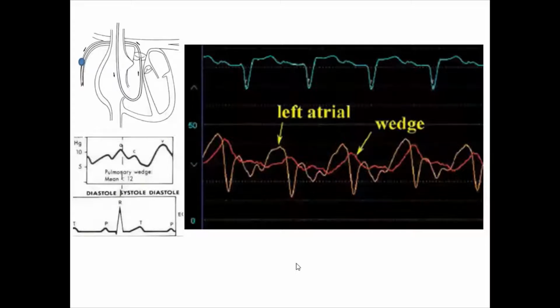So there is a slight time delay and a relatively damped appearance of the pulmonary capillary wedge pressure, or slightly lower pressure compared to the left atrial pressure.